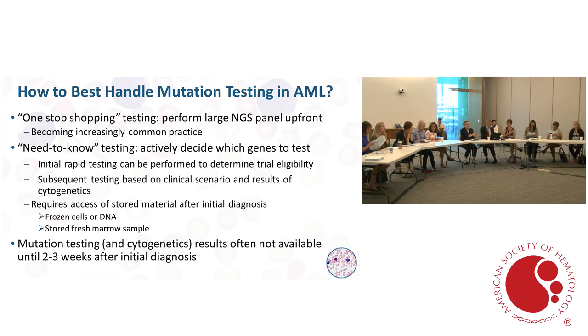So I think you can easily see that this would be, I think we lost this. The top on the left, you see what appears to be a yellow signal. That's the normal signal pattern for MLL. And the red and the green signals have split apart. So that would be a positive for a rearrangement involving MLL. We don't know the translocation partner. We'd have to look at the chromosomes to see what the translocation partner would be.